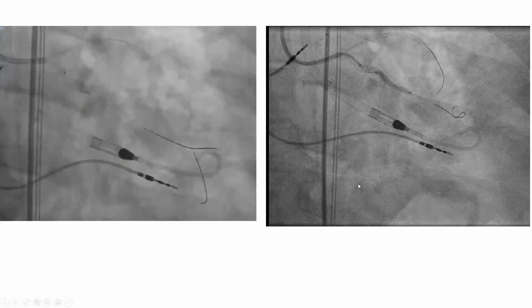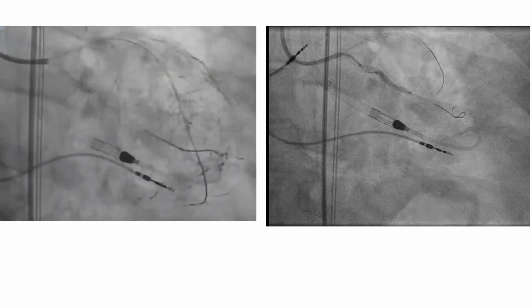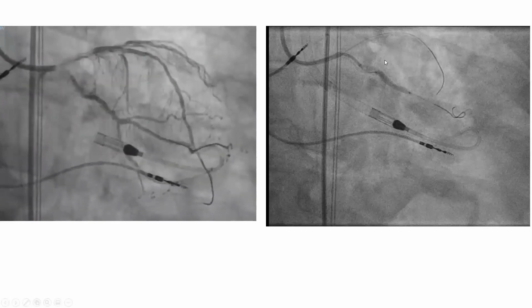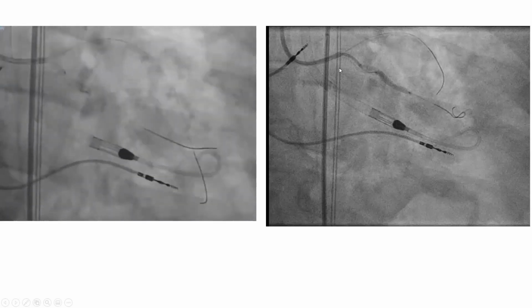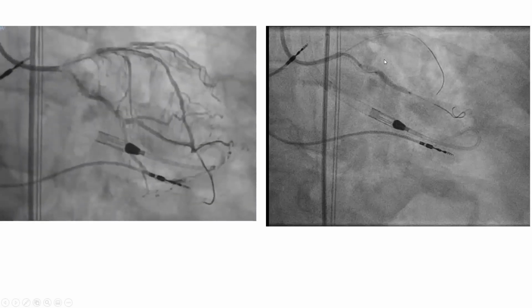This is the time when their Impella pressure became flat for a significant period of time. They even needed to use neosynephrine on top of it. The only time the Impella became flat and neosynephrine was needed is during that circ stent and during guide ventricularization and prolonged left main ischemia.